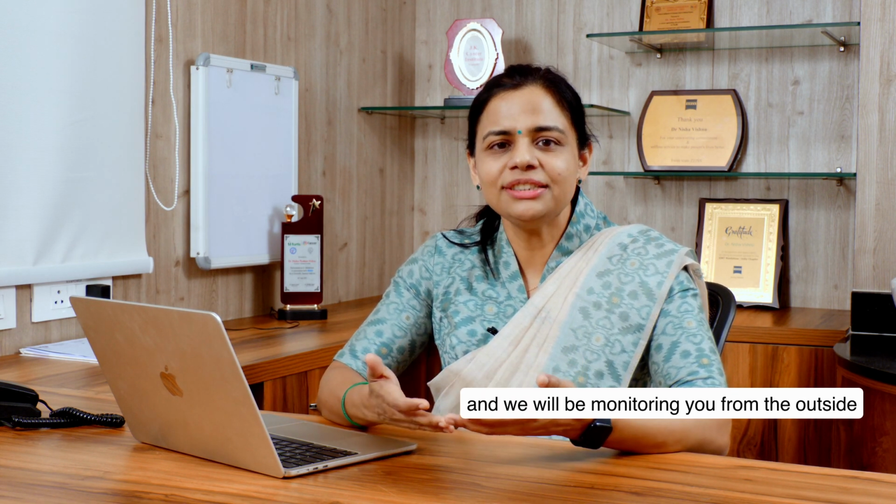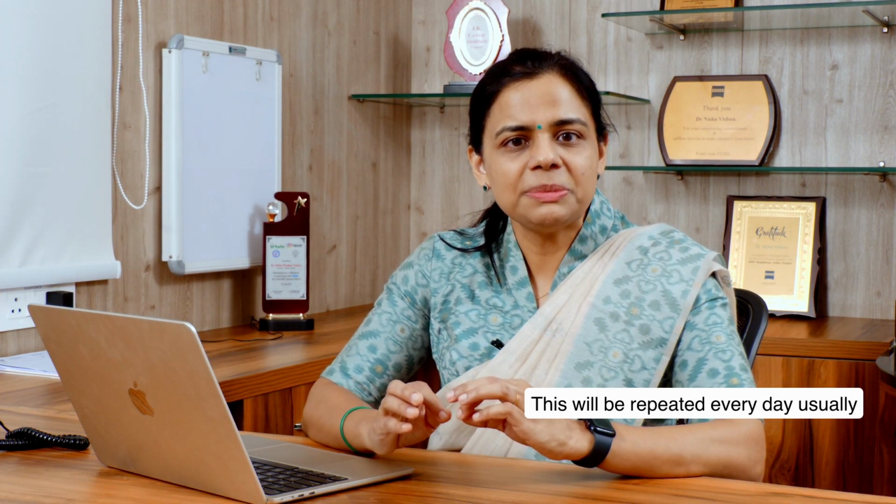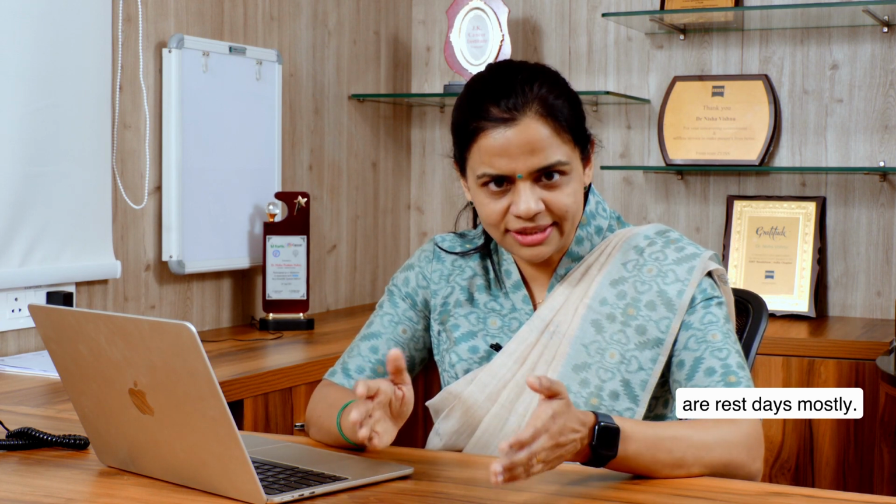The machine, although it rotates around you, will not touch you at any point of time. And we will be monitoring you from the outside through the cameras in your treatment room. Hence, all you need to do is to relax and not move. This will be repeated every day, usually from Monday to Friday. Saturdays and Sundays are rest days mostly.